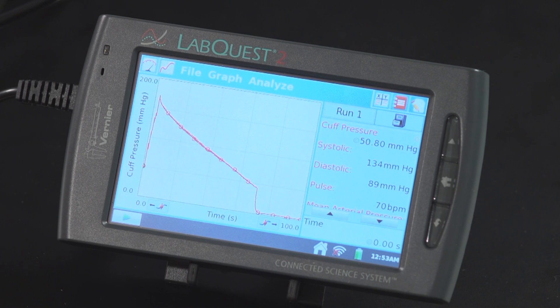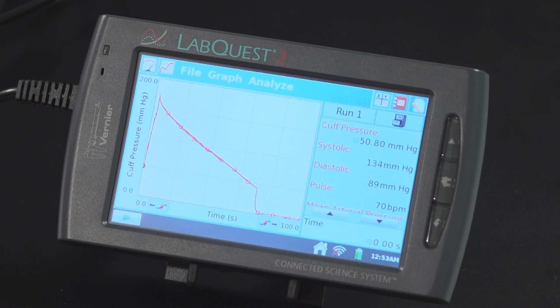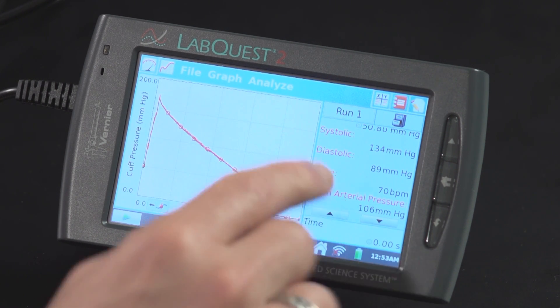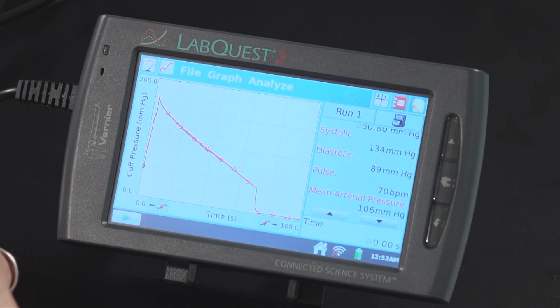The LabQuest 2 is finished collecting data. I'm just going to scroll down a little bit using these arrow keys. My systolic blood pressure was 134 — that's a little bit high, but I run a little bit high; 130 is pretty normal for me. My diastolic pressure is 89, around 90. My pulse was calculated to be around 70 beats per minute, which is pretty normal for me. And my mean arterial pressure was around 106 millimeters of mercury.